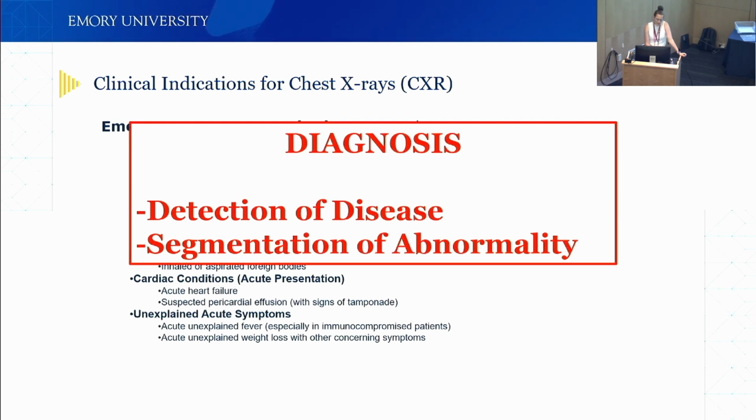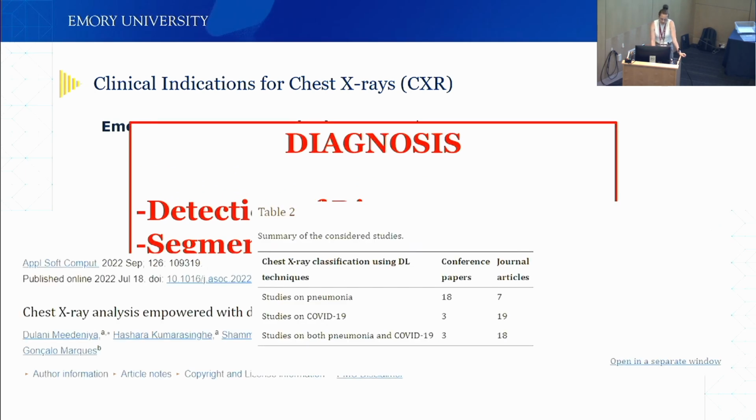Again, we see a lot of detection of disease and a lot of segmentation here. I think COVID definitely caused a boom in this area, where we see a lot of studies on pneumonia, COVID pneumonia, where these patients come to the emergency room.